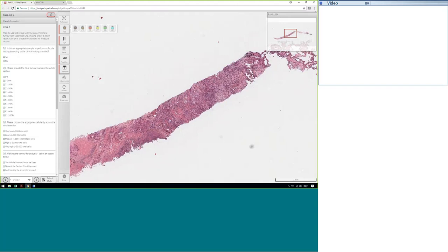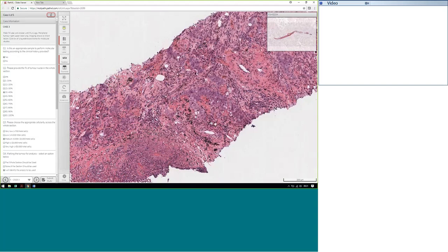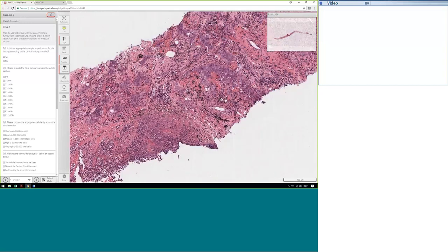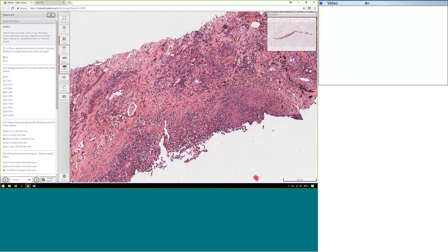No, I was just going to comment on that necrotic area, because that is one of the things that a lot of people are concerned about, is including this necrosis. And as you say, it's in the middle, and it's very difficult to get outside of that. The only way, I guess, would be to sacrifice this portion. However, there are some good tumour areas within that portion. We could take it from there and take it from there. But I think this portion of tumour is probably worth the sacrifice of slight quality with the necrotic areas.